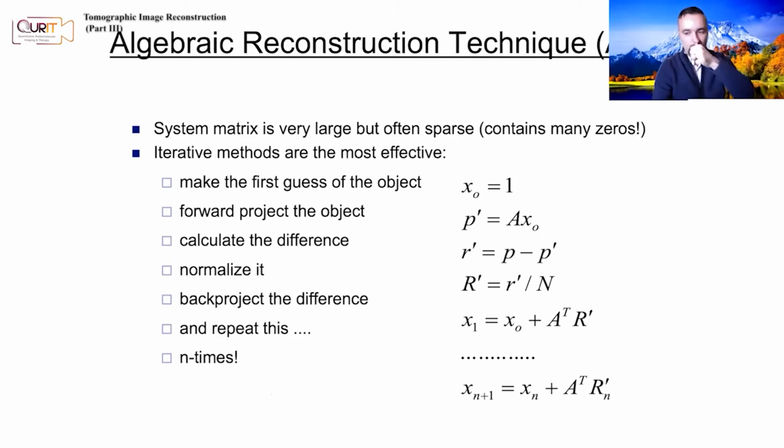P is equal to A times X. How do I arrive at a solution without inverting the matrix or doing those large inversions? So not thinking about noise. Is there a way to solve those sets of equations? So people have come up with different algorithms, not necessarily focusing on the noise aspect of things.